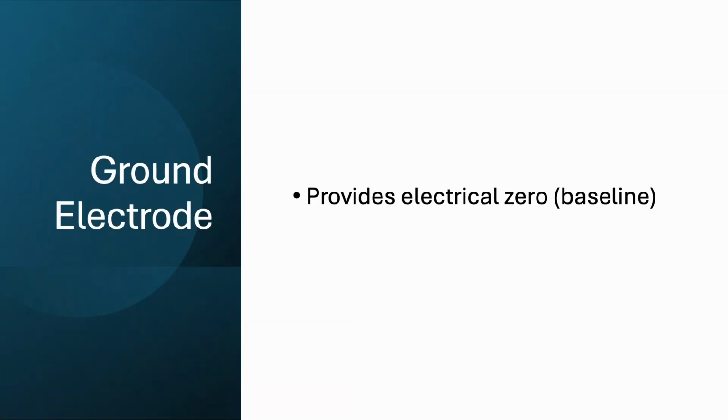The ground electrode is responsible for an electrical zero or baseline. Without a good, stable ground electrode, the exploring electrode pairs will not have a respective electric zero and therefore will wander with respect to equal inputs, thus picking up signals that would otherwise be canceled out. This wandering common potential may cause voltages at the amplifier inputs to exceed the zone where the amplifier is linear, causing amplifier saturation. Okay, that's enough of that.